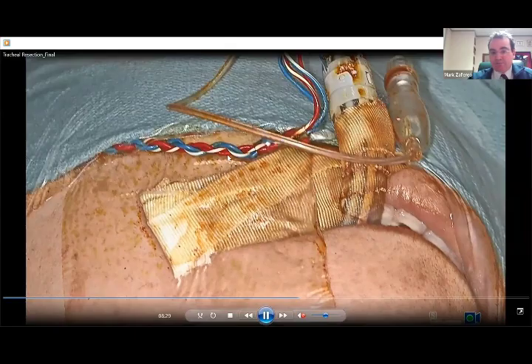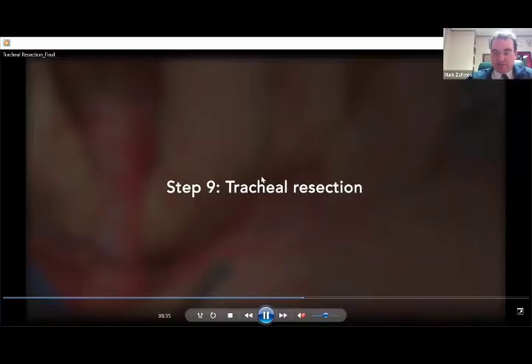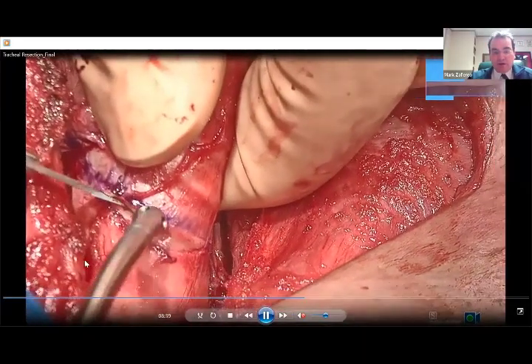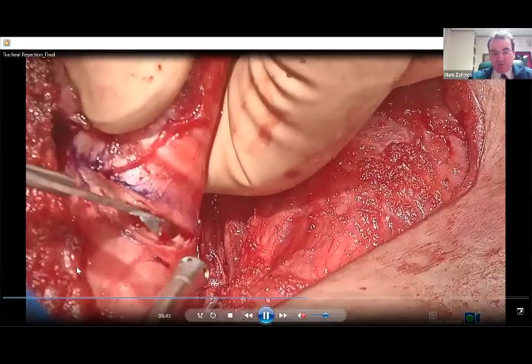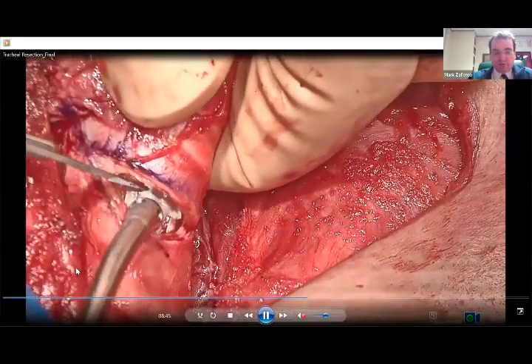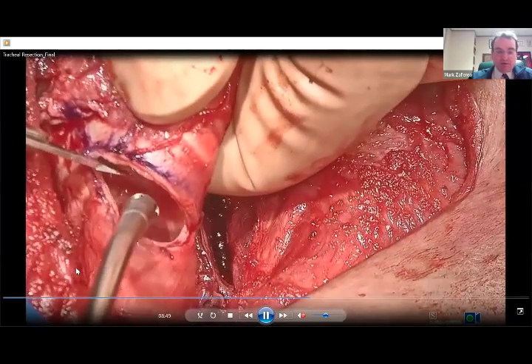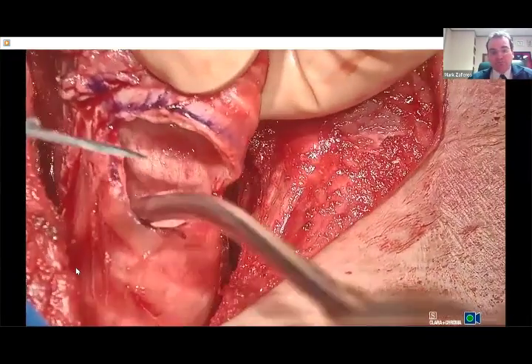We are using a NIMS monitor. You can continue to use the NIMS tube even after the tracheal resection. You just need to slide the tube back in. So you make your inferior cut here, and you put the balloon down. Obviously, as a surgeon, if you prep the tube in, you're controlling all this. So you're putting the balloon down yourself. You're pulling the tube back. You're intubating the patient with a wire reinforced tube here.